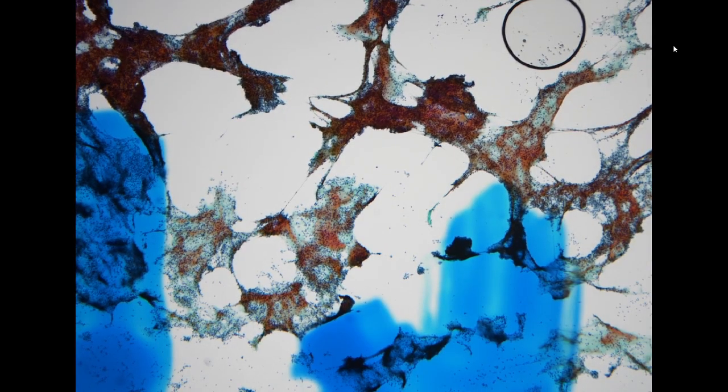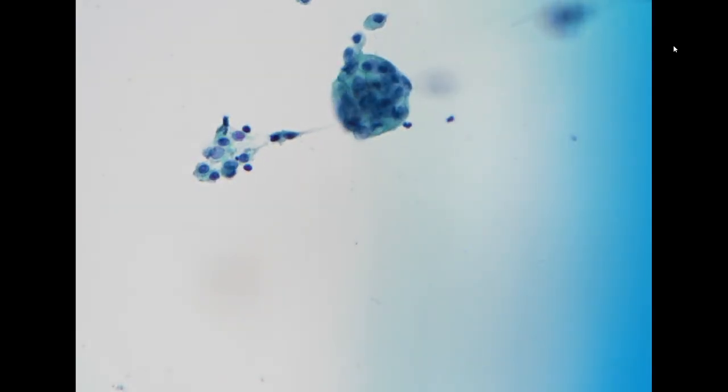Okay, so the first patient is a 74-year-old female. This is her pleural effusion specimen. We see a lot of inflammatory cells, and there were very tiny, small clusters of cells. The nucleus looks median in size compared to the adjacent cells, but you can see this is a very tight cluster with a glandular feature and also shows some luminal border.